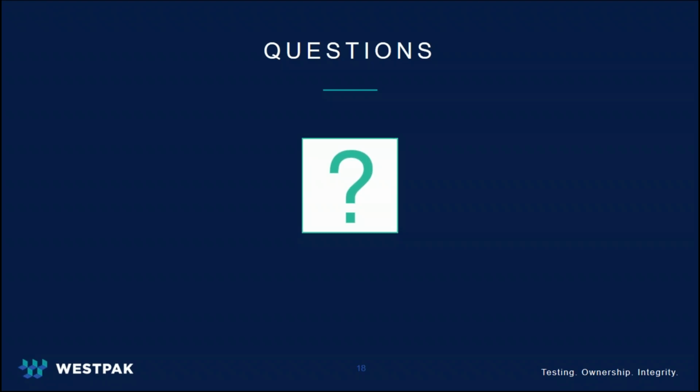Great, thanks, Nico. Next question is, are voids in the seals considered failures? For our product and sealing process, we do see similar voids, but consider it acceptable. Voids in the seals are not considered failures. However, similar to the first question answered, I would recommend looking into the cause of the voids in the seals. It may be caused by setup of the wrong sealing parameters or a faulty sealer.